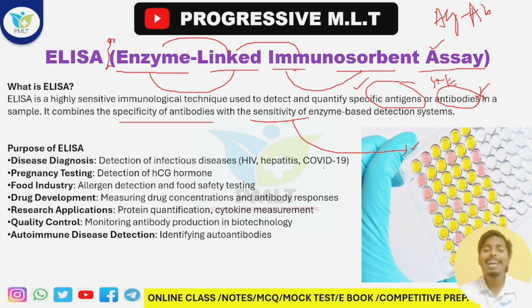See why ELISA is important and why we do the ELISA. Just come with me, you will understand everything. First one is disease diagnosis. Any kind of disease where antigen or antibody is present, like HIV, dengue NS1, dengue IgM, hepatitis B, hepatitis C, any kind of pathogen or antigen we can detect by ELISA. And during the pregnancy test, we can also use it for understanding the beta HCG hormone.